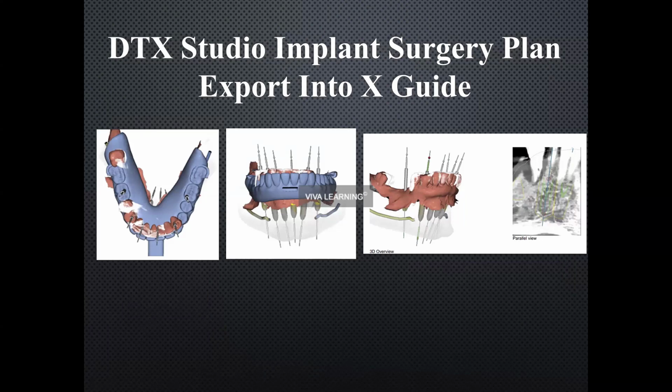Once I approve that, then Stephen will take another few days in the lab, export my CBCT with my preliminary planned implants in place. And once that was finalized as far as the setup, then we will get together again and look at my preliminary implant setups and tweak those any way that need to be tweaked to have ideal placement. So coming out the occlusals of the posterior teeth and a little lingual here in the anterior. In this case, you can see we were lucky enough that we were able to do an all-on-6 and sneak 2 implants behind his mental foramen.